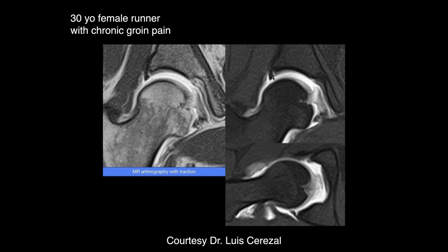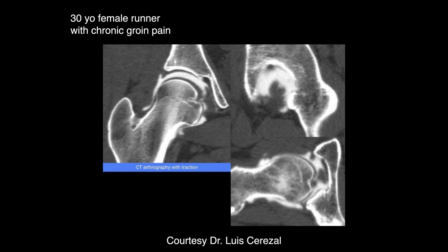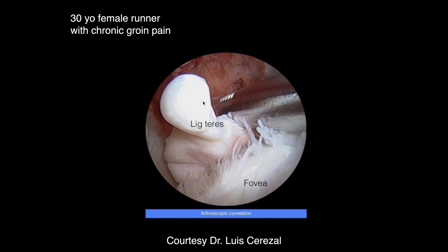There is a defect at the junction of the labrum and articular cartilage. When smooth like this, it is generally considered a congenital variant. On CT arthrogram in the same patient, contrast is seen going into the ligamentum teres through the ligament, confirming a partial tear.